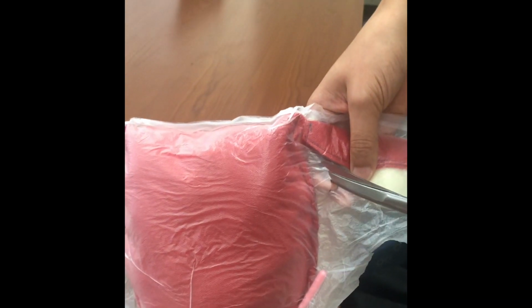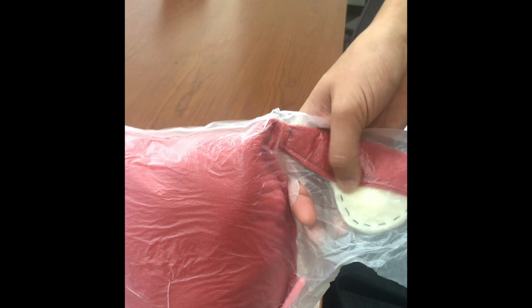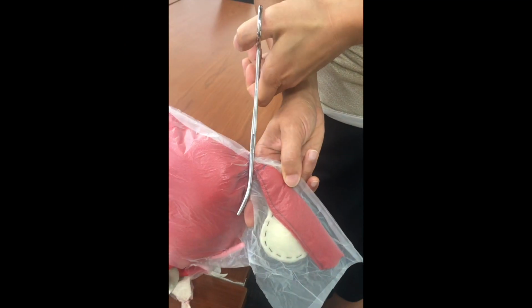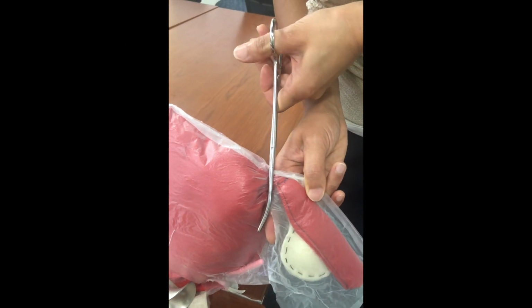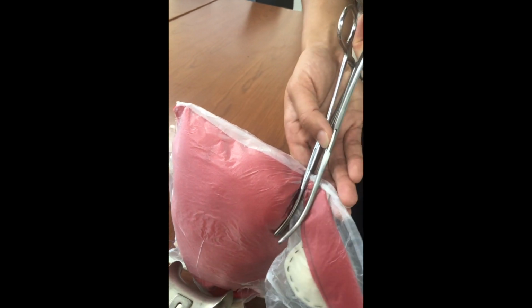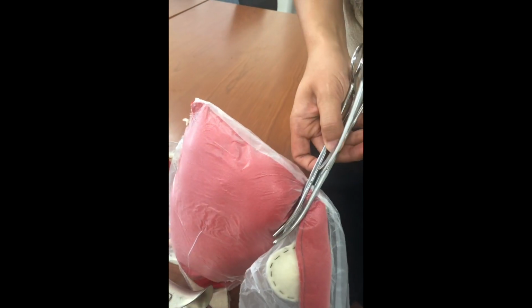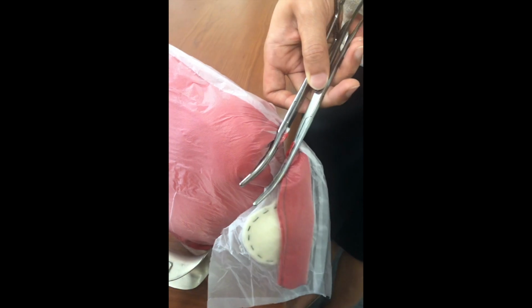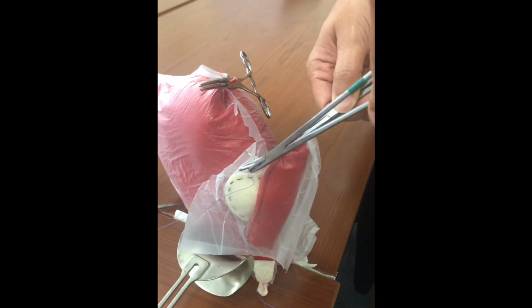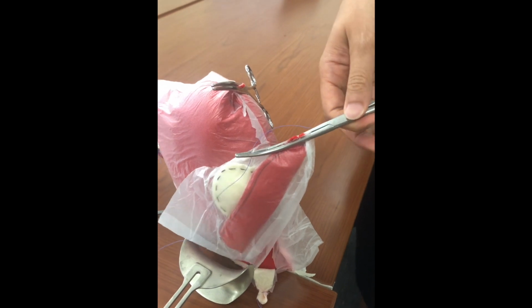In reality, you would use a bovie to create the window, but for the purpose of simulation, we are using scissors here. Now use 2 curved Kelly clamps and double clamp the fallopian tube and the uteroovarian ligament. Cut between the clamps. Then suture ligate the pedicle with a Heaney stitch, as shown here.